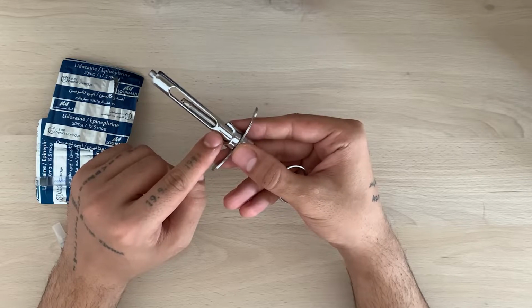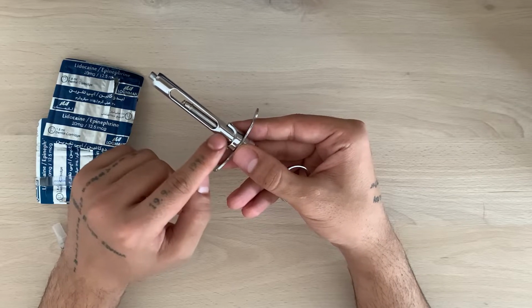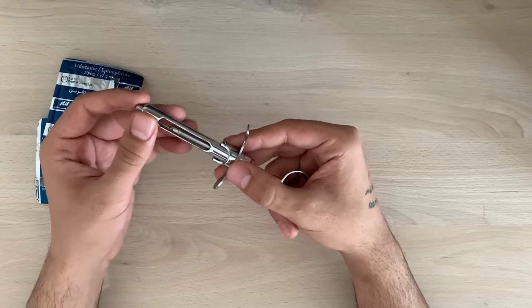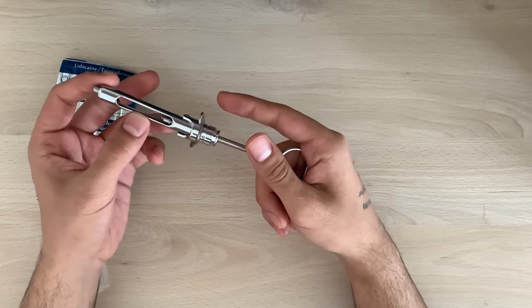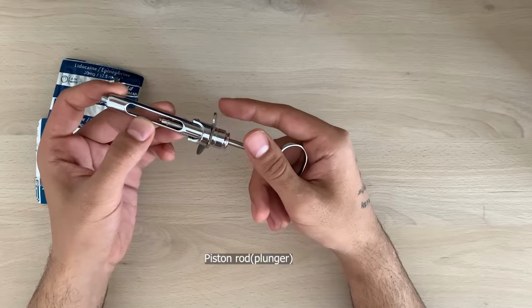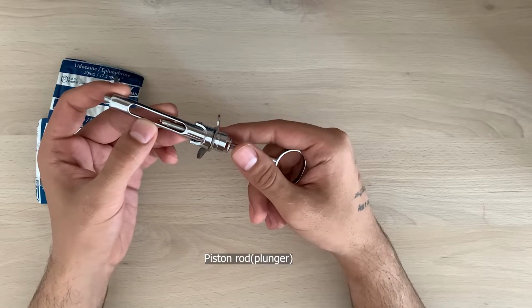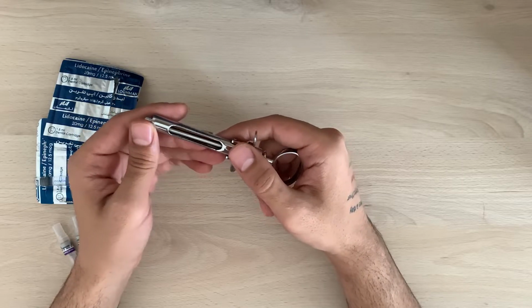And this part is called the barrel, where the anesthetic carpule will be added. This part, which is moving, is the piston rod or plunger, which pushes toward the rubber stopper and releases the anesthetic solution through the needle.